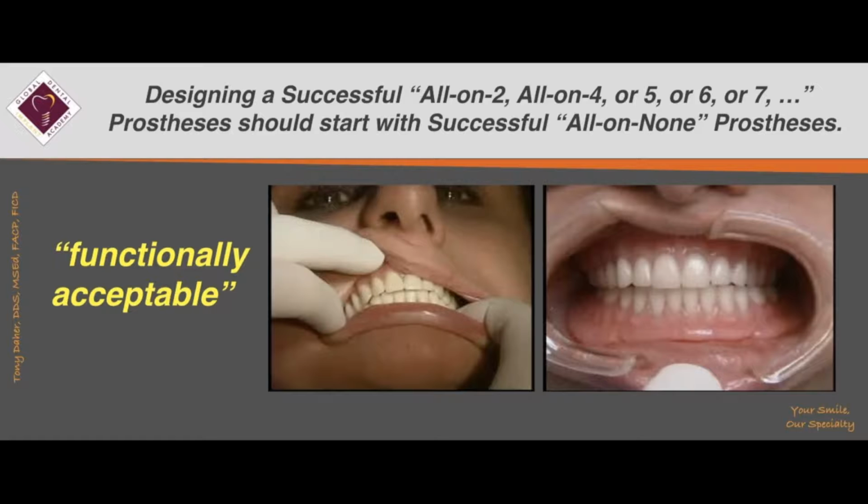I want to show you 2 different videos here. The one on the left side is the existing denture, and I want to show you the type of occlusion that the patient has. You see the teeth are set up in a class 1 skeletal relationship. Most lab technicians will do that for you; this is the norm that you see in a lot of dental labs. So let me show you that video.